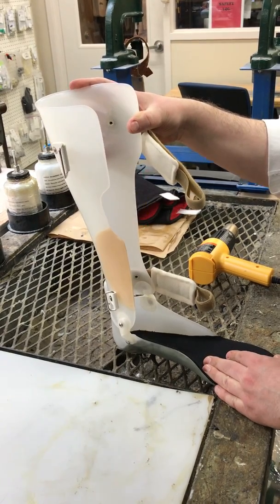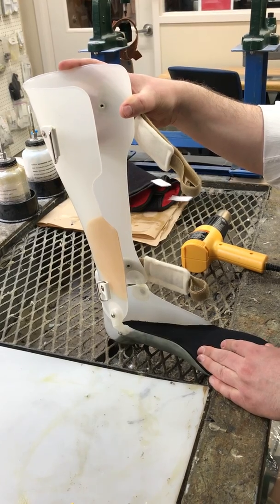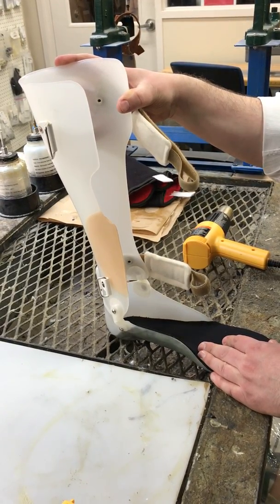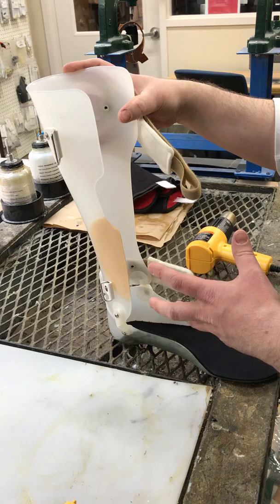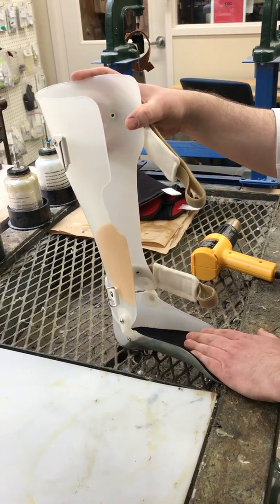This video is going to show how you can adjust the ML dimension of an AFO to be larger or smaller depending on the fit on your patient. Let's say you fit this to a patient and for whatever reason it's a little loose and they're not being held in it tightly and you need to tighten the ML.